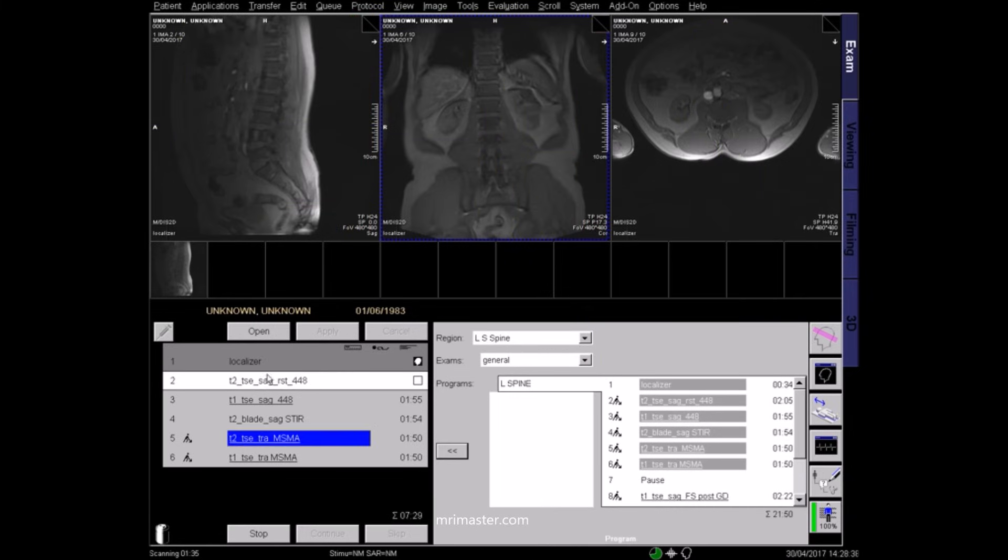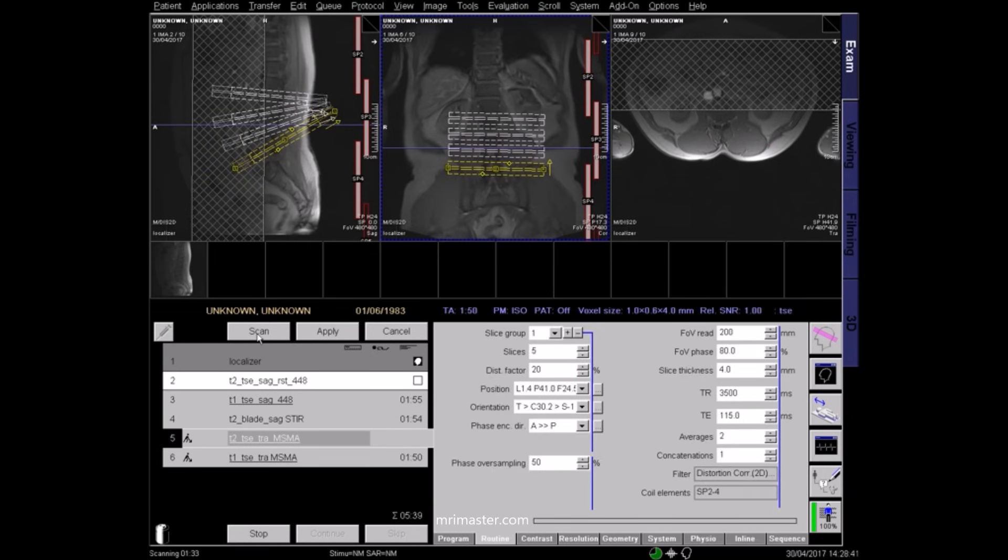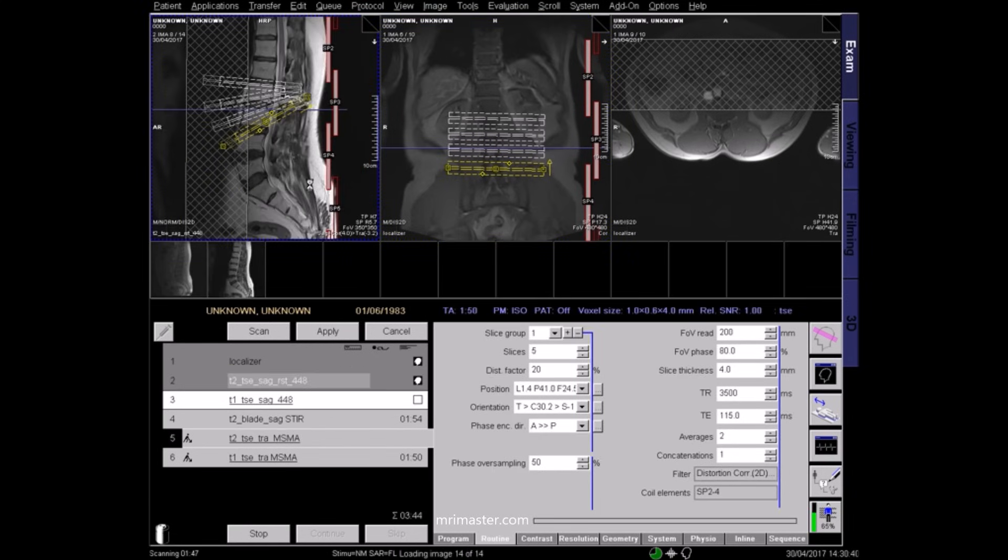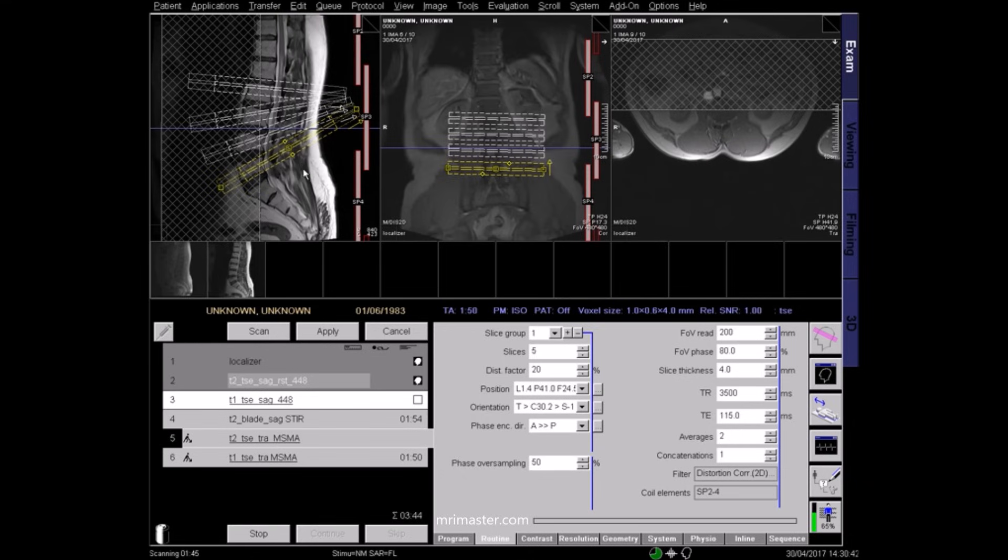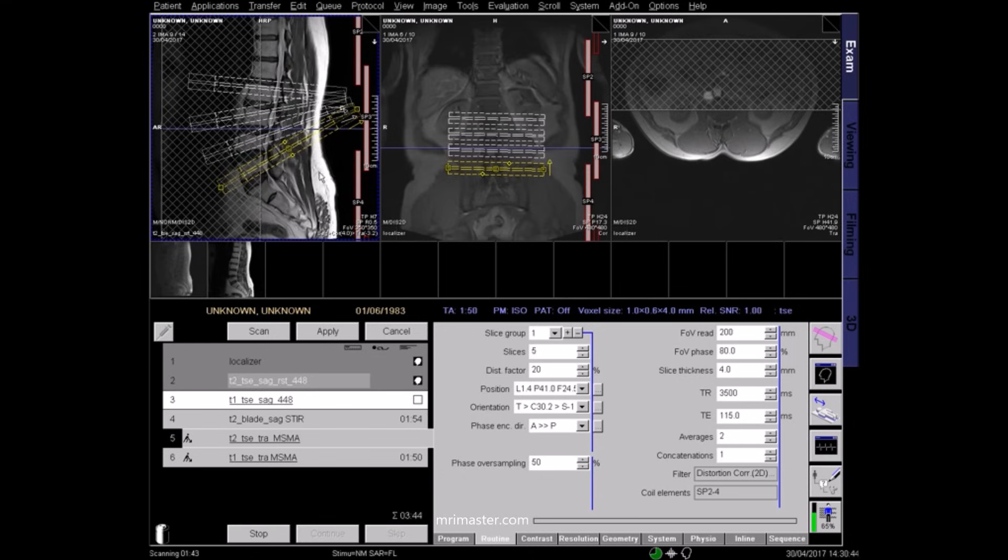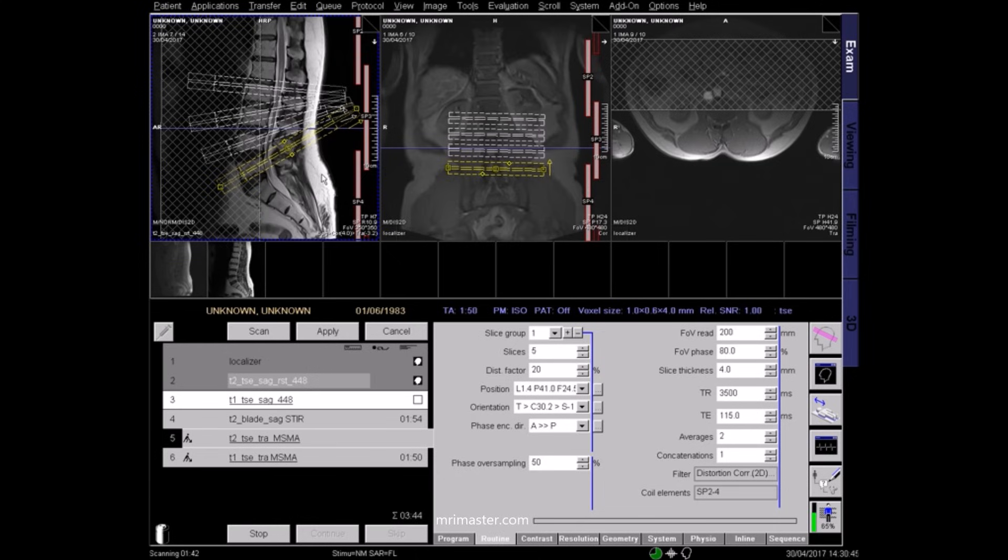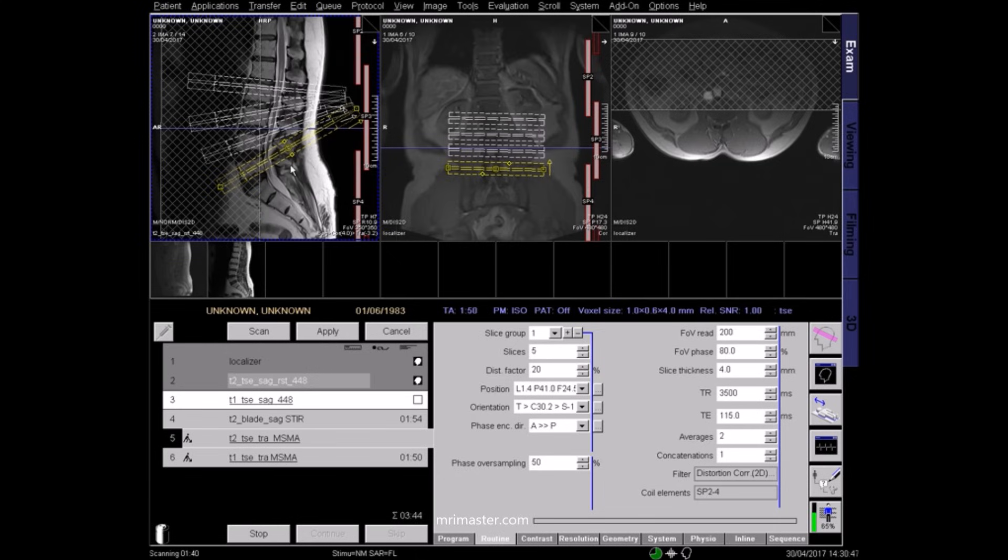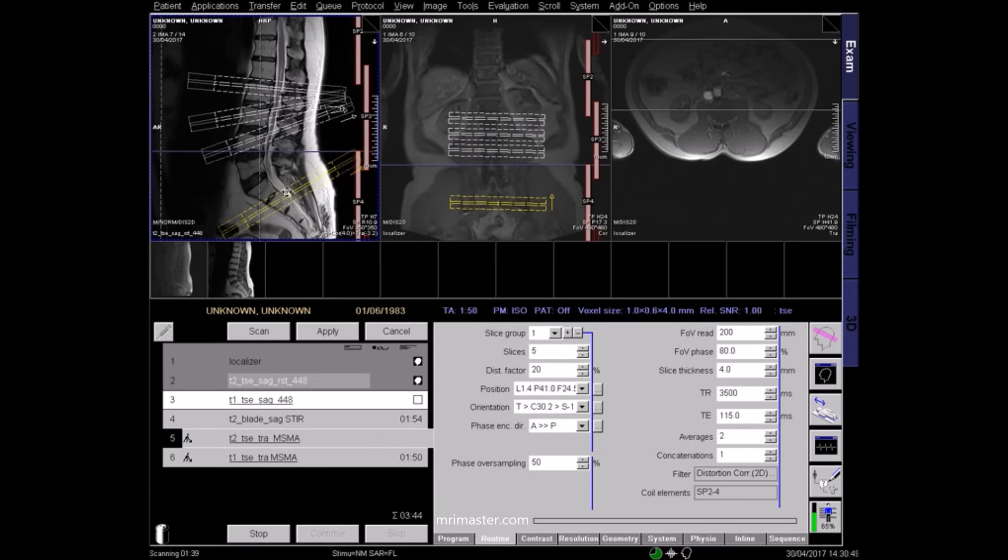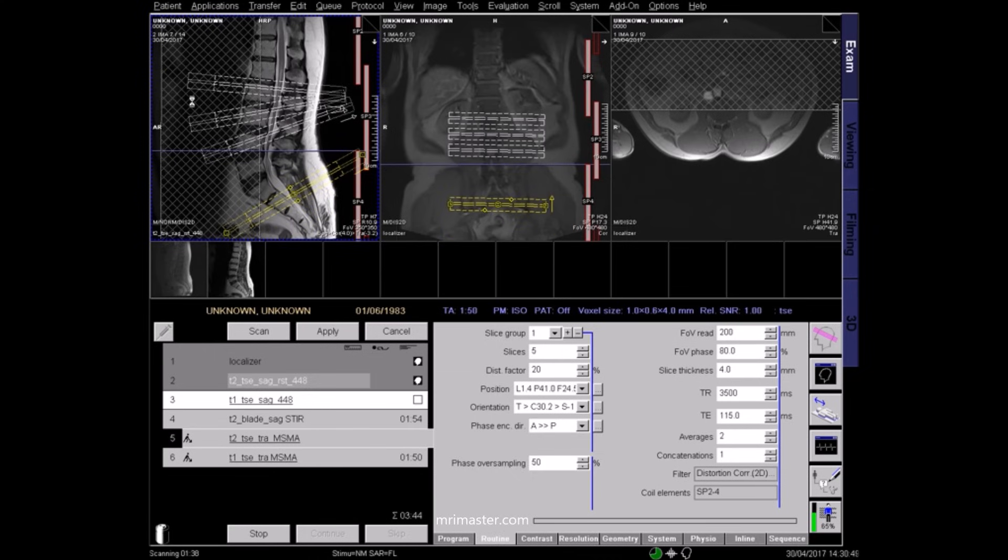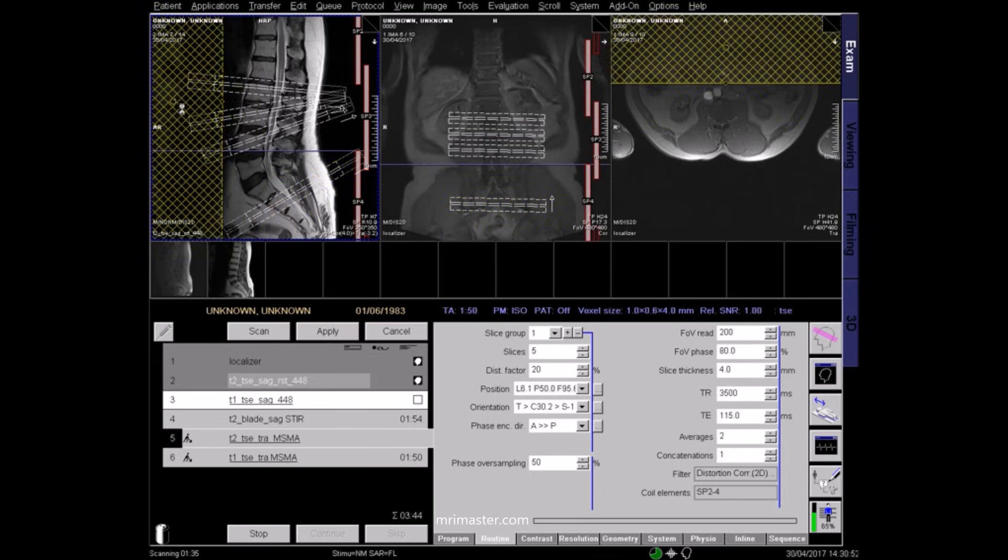Once a sagittal image has been acquired, you can plan your axial sequences. Scroll through the sagittal images to find the central slice. Move the saturation band in front of the vertebra once again to limit artifacts from respiration and vascular pulsation.